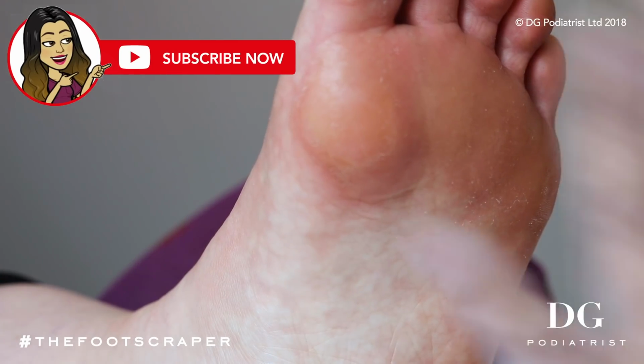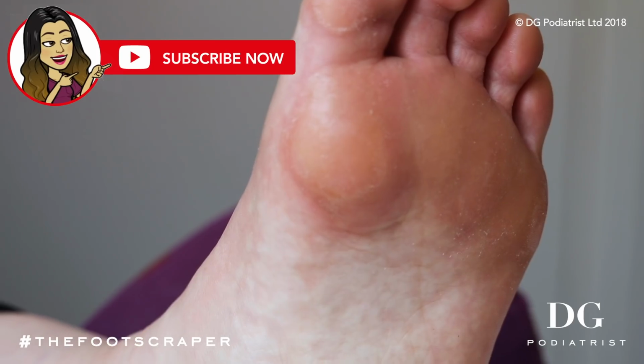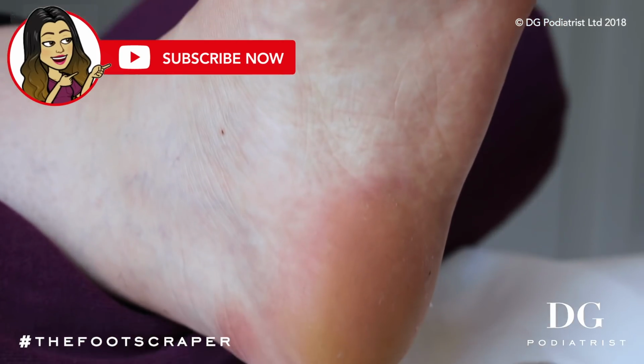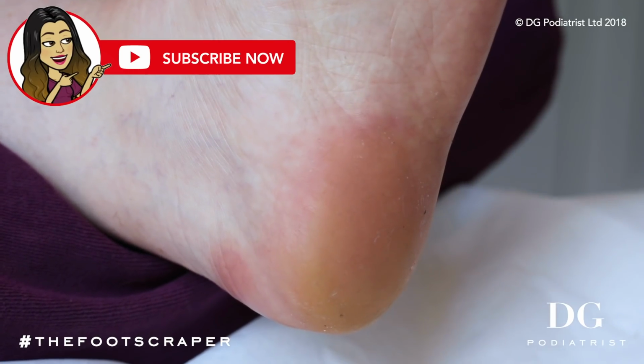So that's when I'm going to be using the device on that to just re-clean it out. Okay. I'm going to focus now down towards the heel. Okay. So you do have a lot that's sort of in this region. Yeah. And going all the way there. So we're going to do that bit. Okay. And then we'll use the machine afterwards.